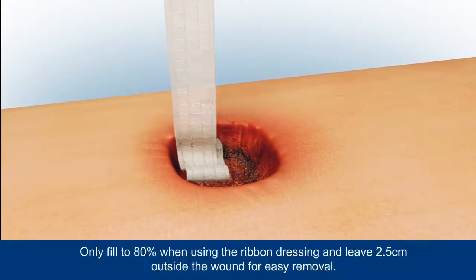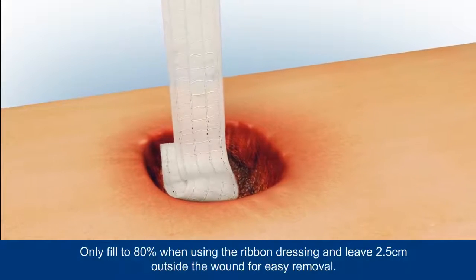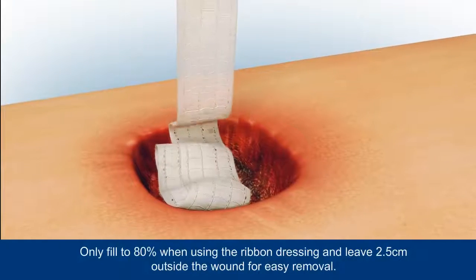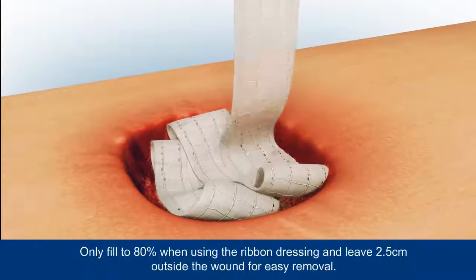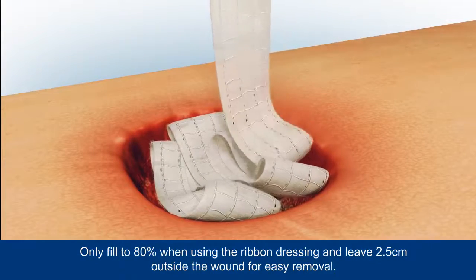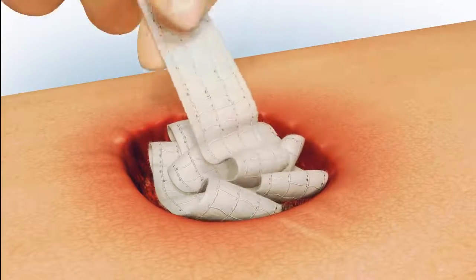For wounds greater than 0.5 cm in depth, Aquacel Extra or Aquacel dressings can be used as a filler — for example, Aquacel ribbon dressing. Only fill to 80% when using the ribbon dressing, and leave 2.5 cm outside the wound for easy removal.